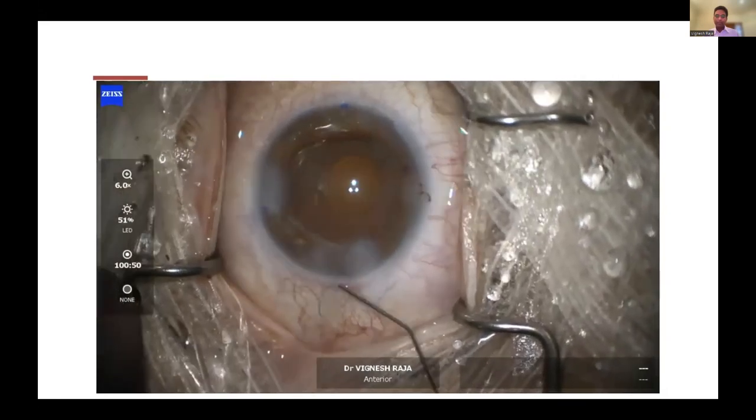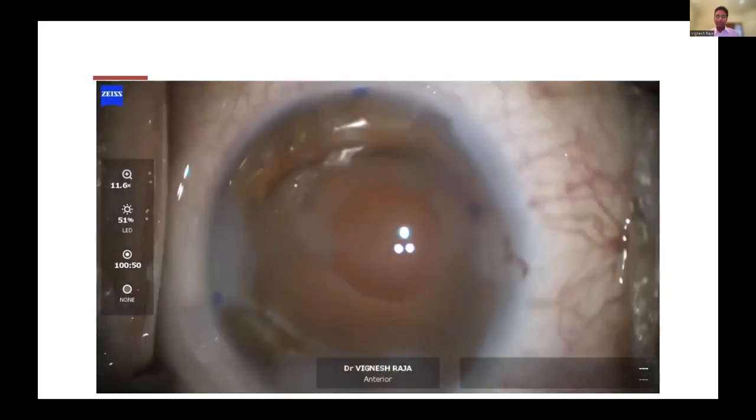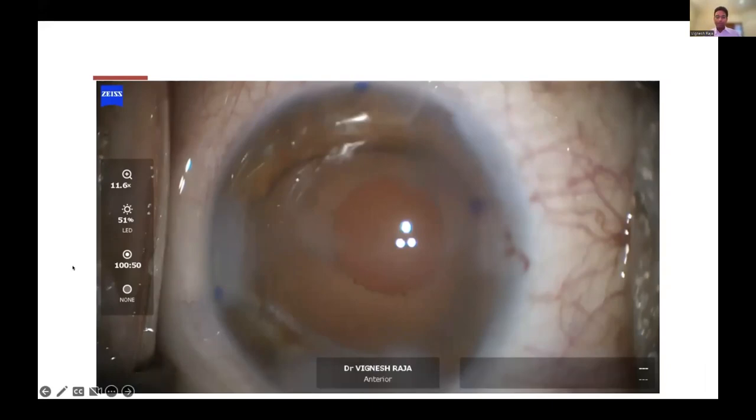So cosmetically, it looks pretty good. And when patients have brown iris, it actually matches the other eye very well. The price of the standard brown one is about $2,000, about 1 lakh rupees. The custom made one is about $8,000, where they take photographs of the other eye and do it. So that's roughly about 4 lakh rupees for the other eye for a custom made prosthesis.